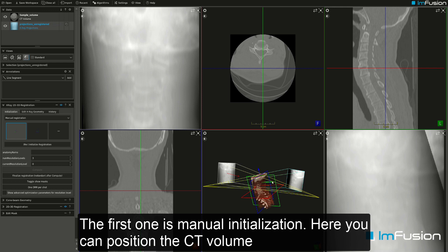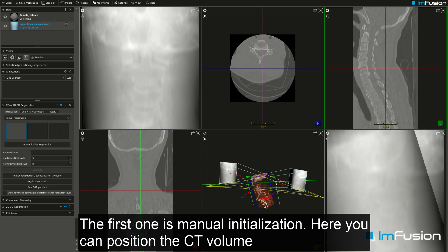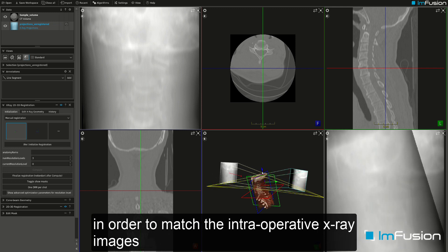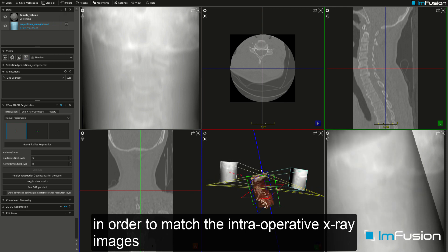With manual initialization, you can position the CT volume in order to match the intraoperative x-ray images.